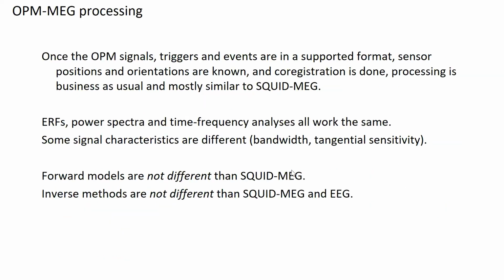And once you have the data well annotated with additional information in the BIDS file format, and once the OPM signals, the triggers, and the events are known, sensor positions are known, co-registration is done, then processing is actually business as usual. And it's mostly similar to SQUID-based MEG. Event-related fields, power spectra, time frequency analysis all work the same as with SQUID-based MEG. There are some signal characteristics that are different, such as bandwidth and tangential sensitivity, but that's not tremendously different.